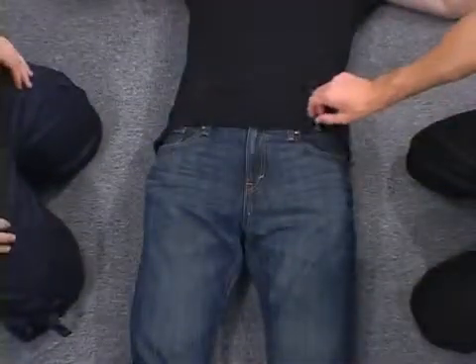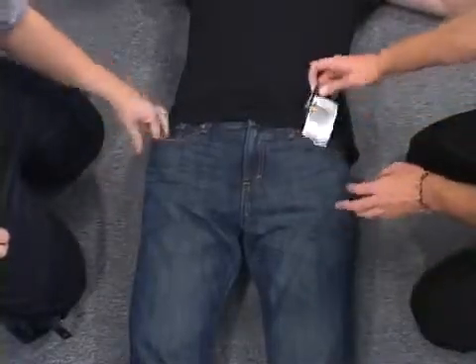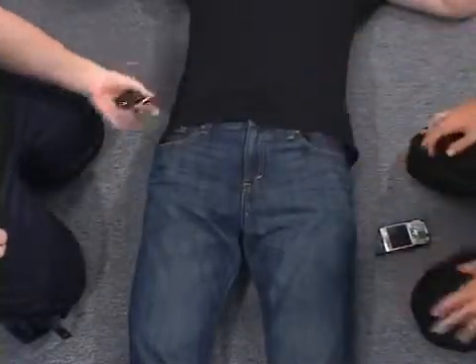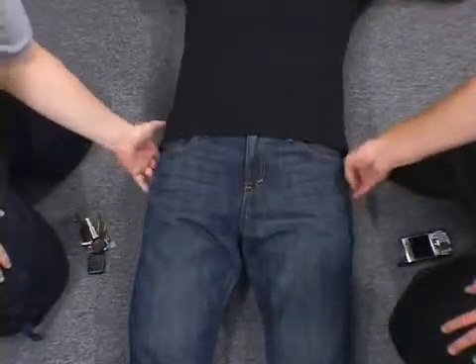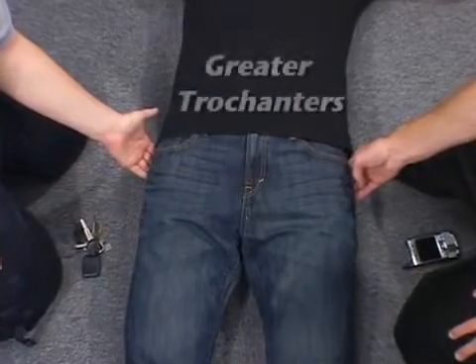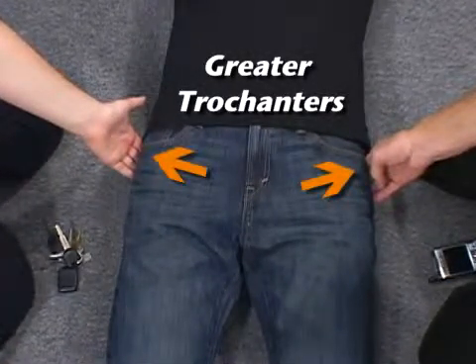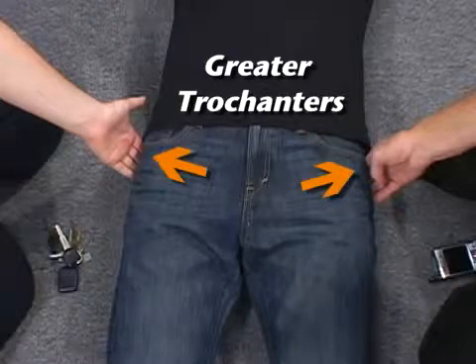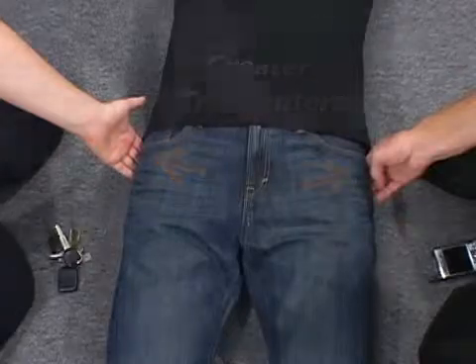Before applying the SAM Pelvic Sling 2, check the patient's clothing, belt, and pockets for any hard objects such as a cell phone or keys. Next, locate the bony prominences on the side of the hips called the greater trochanters. These prominences are generally at the same level of the symphysis pubis and buttocks. This is the correct level for sling application.